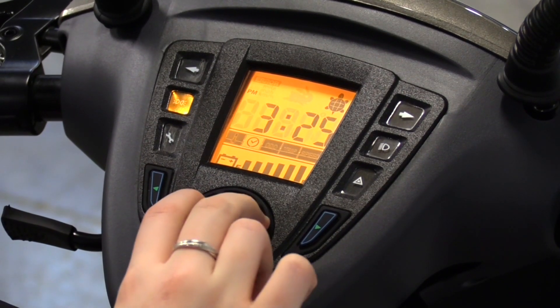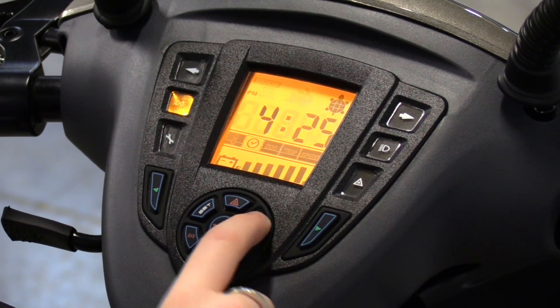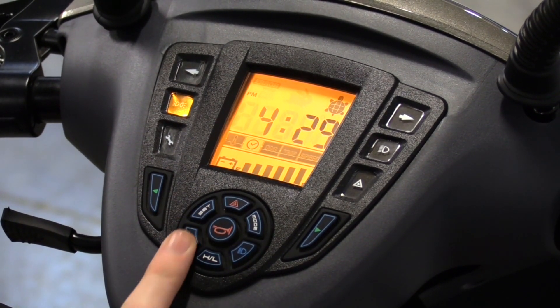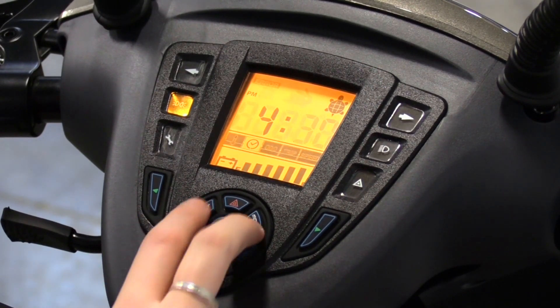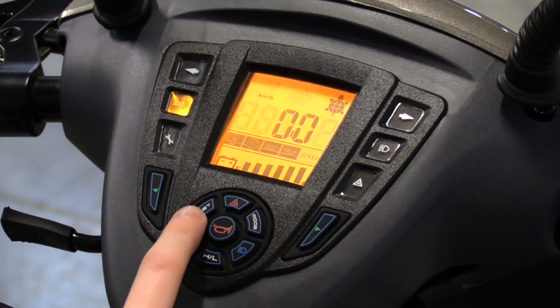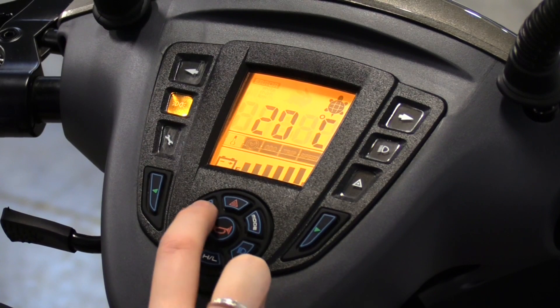To adjust the settings, hold the mode and set button simultaneously. Press the set button to adjust the hour time, then press the mode button to move to the minutes. When you are finished, hold the set and mode button simultaneously for 2 seconds. Use the same method to toggle between kilometers per hour and miles per hour, and between Celsius and Fahrenheit.